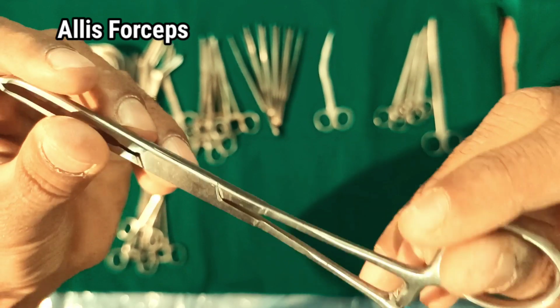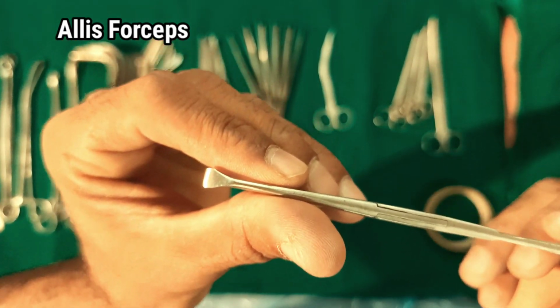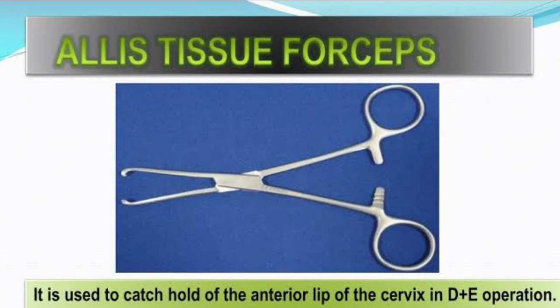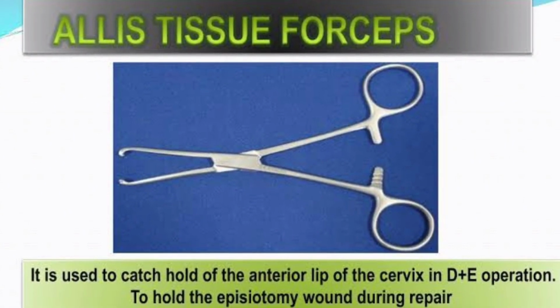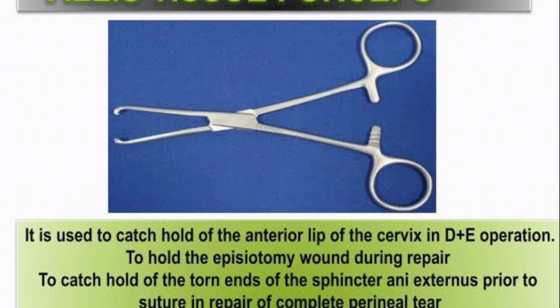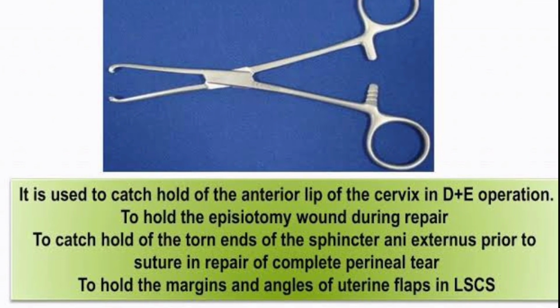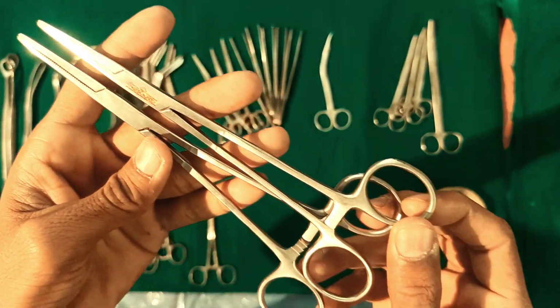Allis clamps can cause damage, so they are often used on tissue about to be removed. When used to grasp the cervix to stabilize the uterus, such as when an intrauterine device is being inserted, an Allis clamp has the advantage of causing less bleeding than the more commonly used tenaculum.